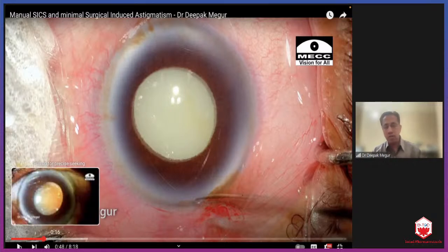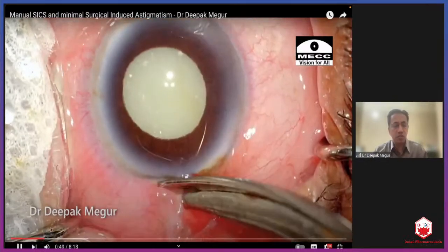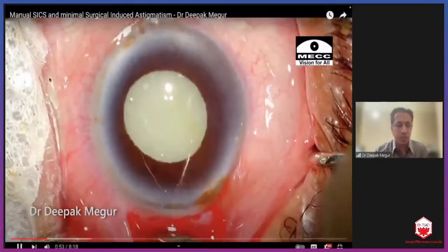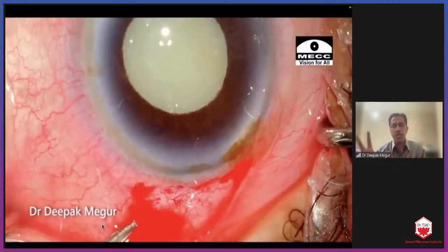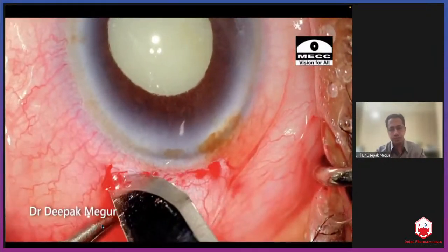And I feel in the modern era, the temporal scleral tunnel incision is the most evolved incision which we can have. And I'll take you through one such case here. I always begin by making a small posterior groove. This is something which I do just to fixate the globe while I'm doing my tunneling. This is the way I fix my globe.